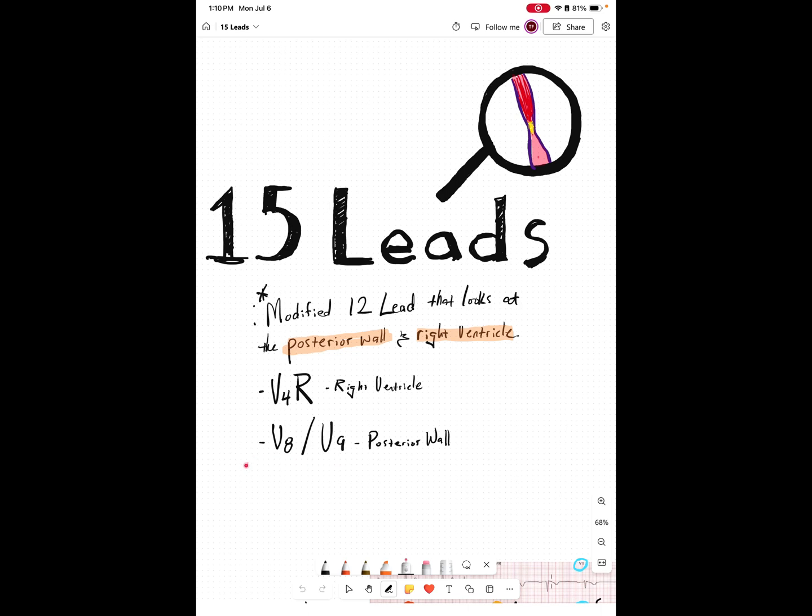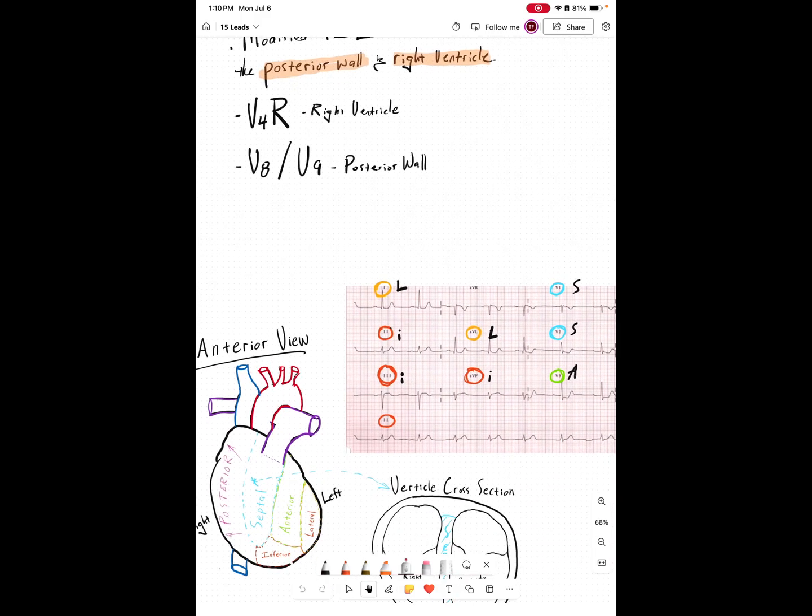This video is going to take a look more at the why behind the 15 lead, and I'm going to attach the video after this demonstrating how to place those leads. So let's take a look at our normal 12 lead, and we'll use that as a stepping stone.